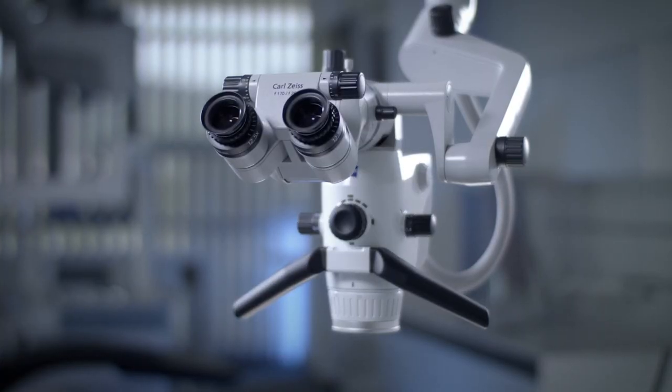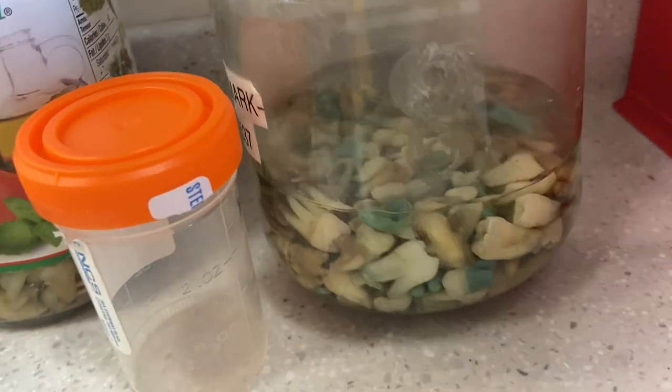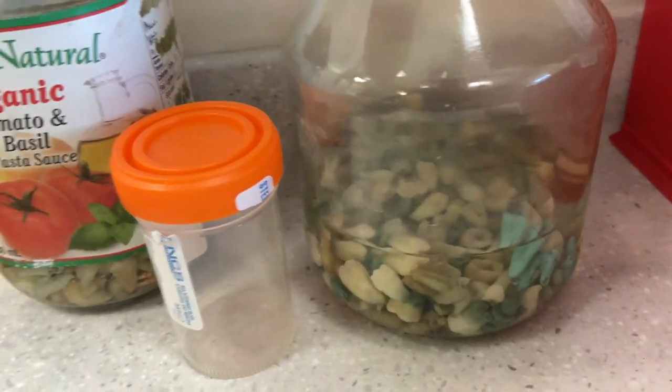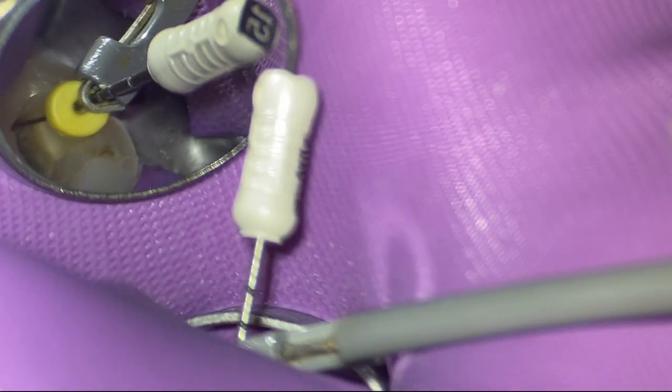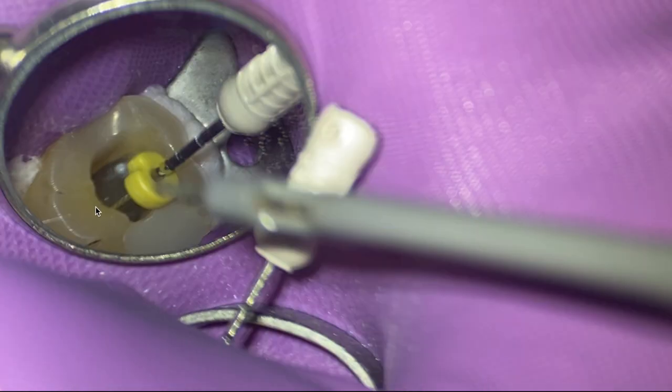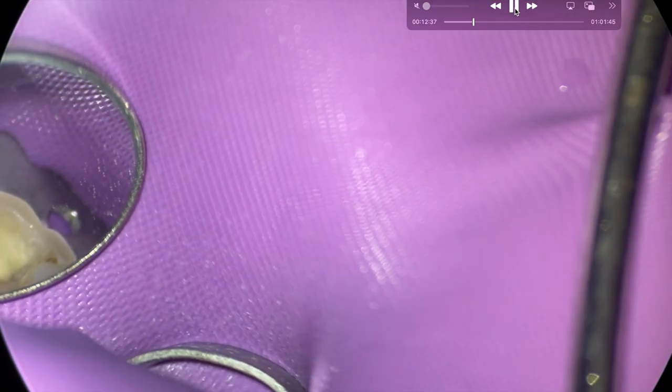I can tell you that using not only the cone beam but also high magnification and practicing on extracted teeth—if you don't feel comfortable doing this, get yourself some extracted teeth and work like crazy because it will boost your confidence significantly. At this point, I'm kind of like, well, I don't think there's anything. So I'm going to take a 15 file, I'm going to get working length on all of my canals.